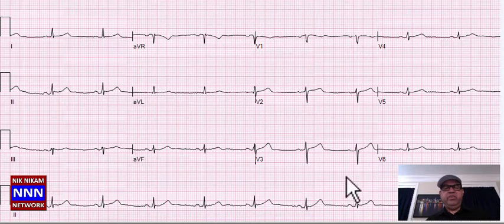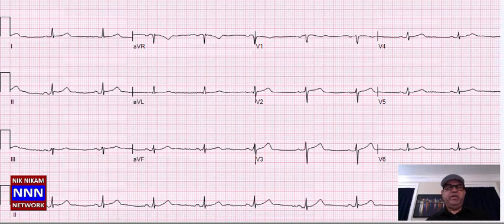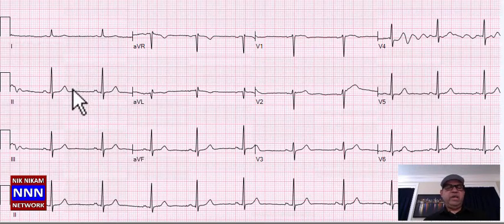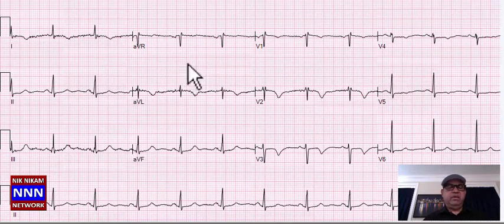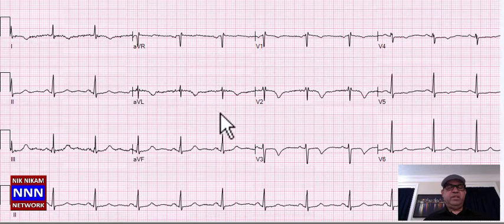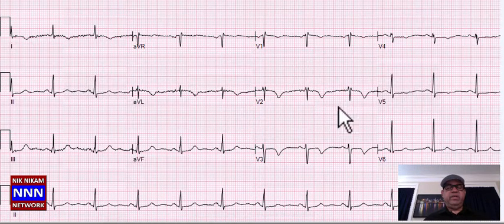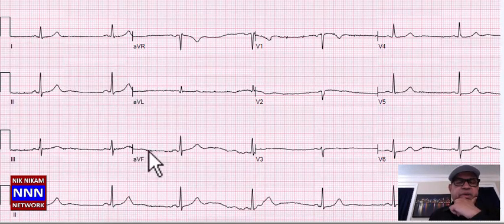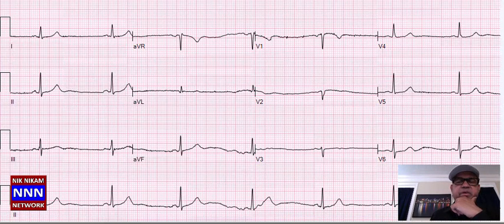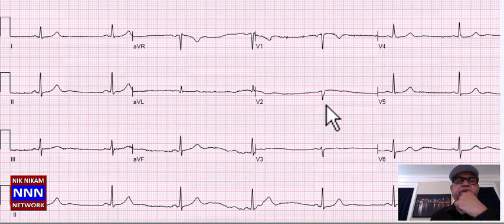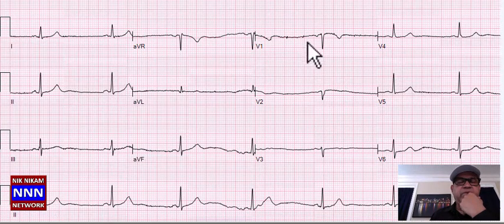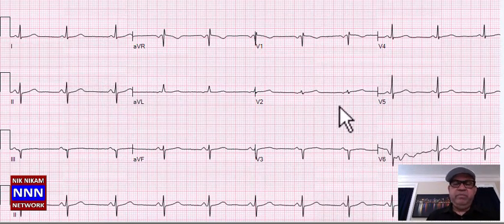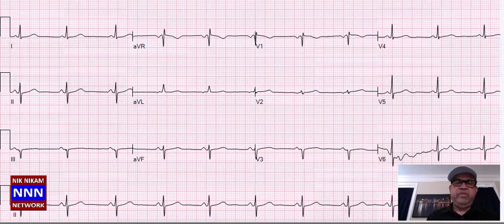Here we have sinus bradycardia. T-waves okay, anterior leads look okay, lateral leads okay — except for bradycardia, nothing really significant. Sinus rhythm, nothing really significant. Again sinus rhythm with non-specific T-wave changes, nothing really of significance. Severe sinus bradycardia, non-specific T-wave changes, and loss of R-waves anteriorly — may be a patient with severe bradycardia and possible old anteroseptal myocardial infarction.